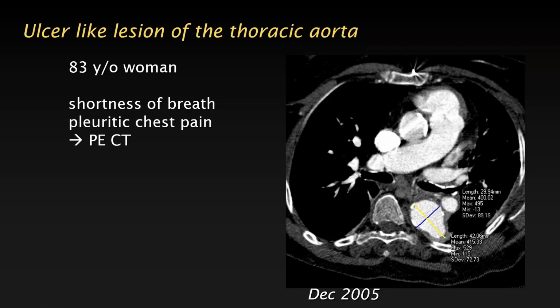So the question again is, is this an acute penetrating atherosclerotic ulcer? In other words, do we need to call cardiothoracic or vascular surgery to consult with this patient or potentially treat her? And then you say, well, the two points we have to clarify are: is she symptomatic, and does she have an intramural hematoma? The symptoms don't really fit very well.